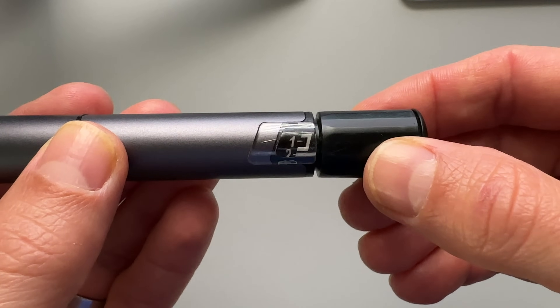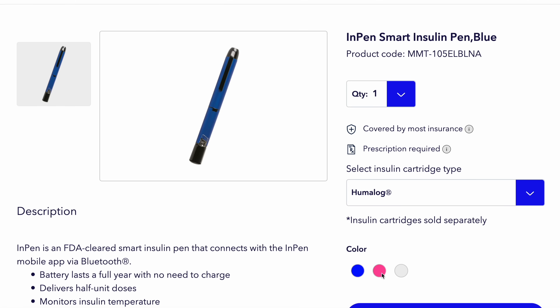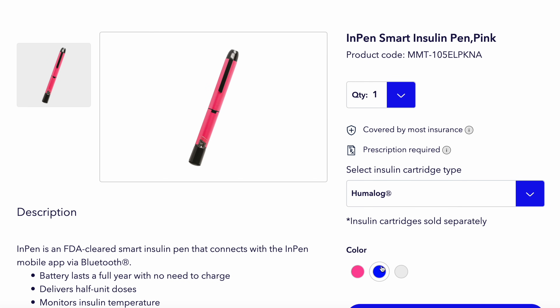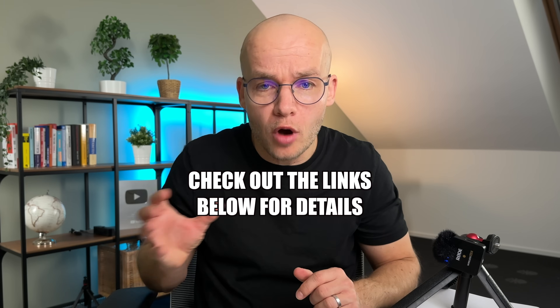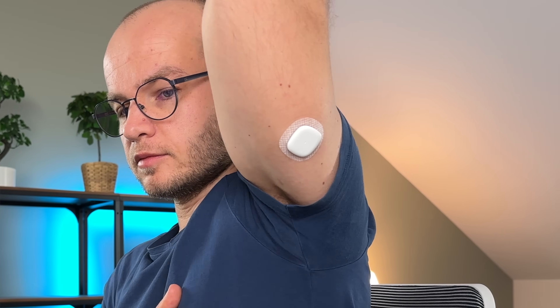This allows me to be more precise with my meal and correction doses. For me, this is super important because half a unit of insulin can make a 30 to 40 unit difference in my post-meal sugar levels. I have my InPen in gray color, but depending on the country and type of insulin used, there are more colors available. What I really love about this system is that both the smart pen and my CGM pair with my phone via Bluetooth. InPen works with most iPhones and Android phones, so unless you have a really old model, it'll probably be supported. I tested the system with the Simplera sensor, which is the latest CGM sensor from Medtronic, designed specifically for this smart MDI system.